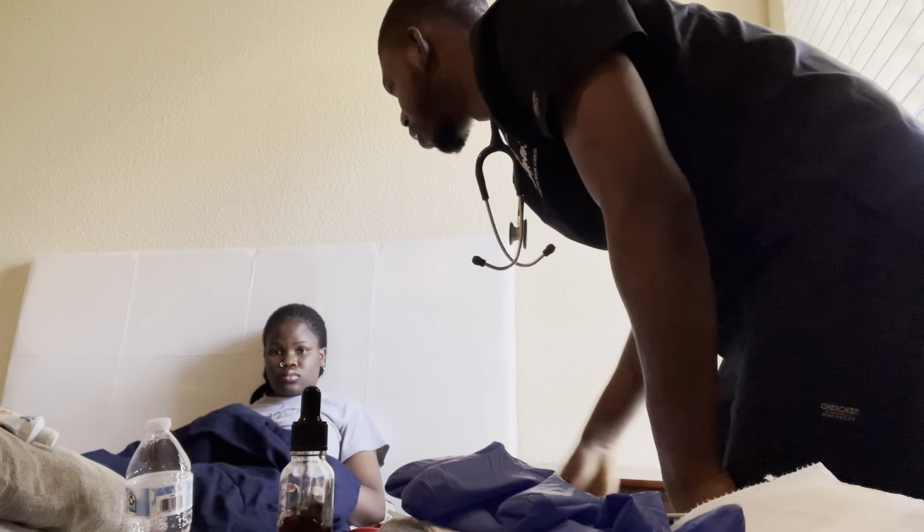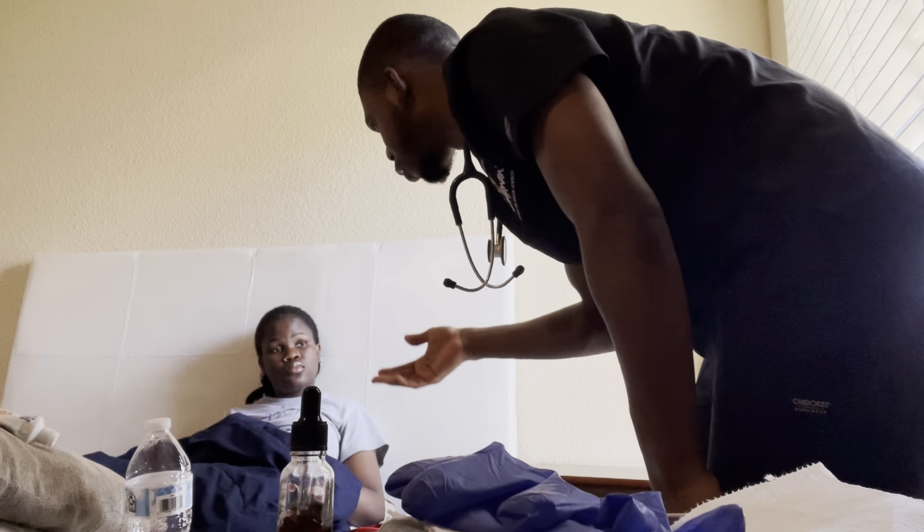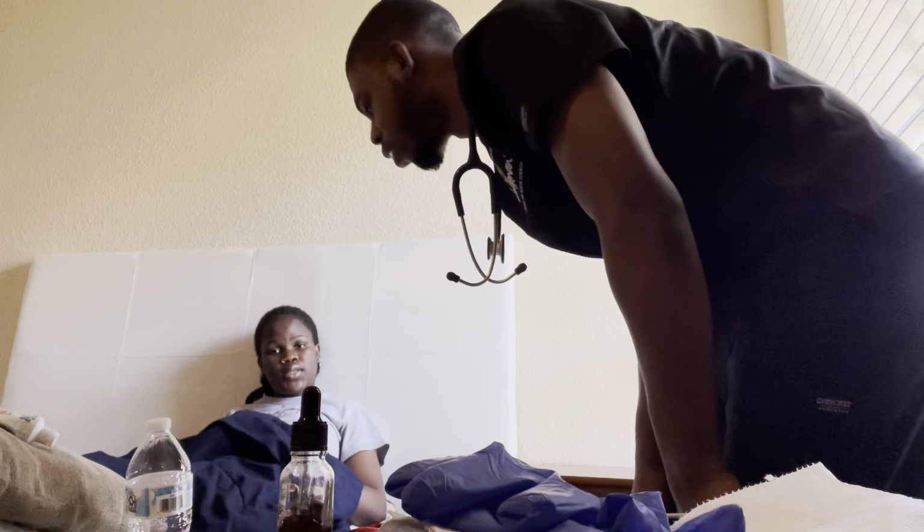Ma'am, today I will be suctioning the secretion. I will be removing the secretion in your mouth so that you can be able to breathe well. Are you okay with this procedure? Yes, go ahead. Okay, thank you.